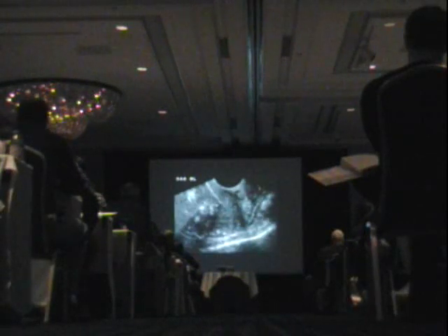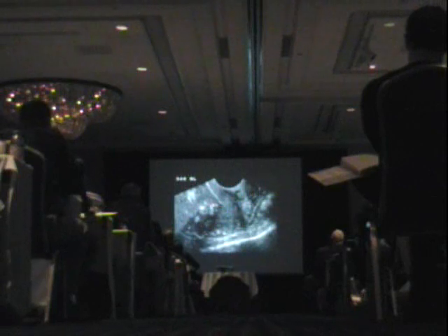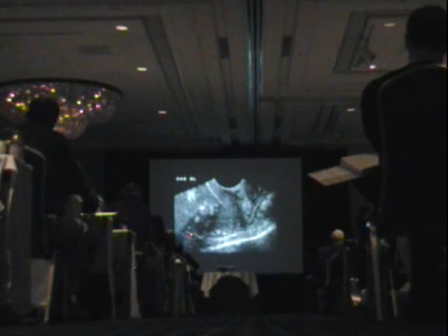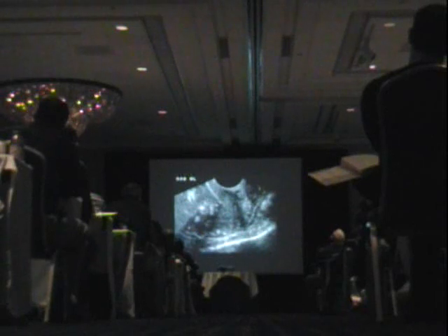And this is a postmenopausal uterus where you see that the cervical component of the uterus is just as big as the uterine body and fundus, and you have these speckled calcifications that run all along the surface of the uterus, somewhat linear. These should not be mistaken for fibroids or for some horrible tuberculosis infection. That's normal postmenopausal calcification.